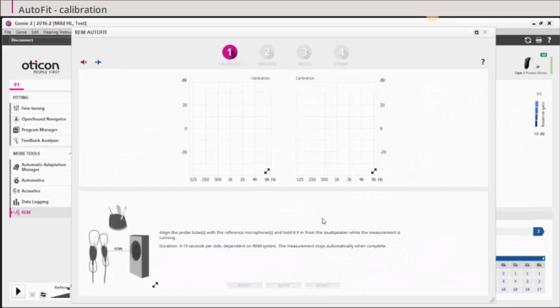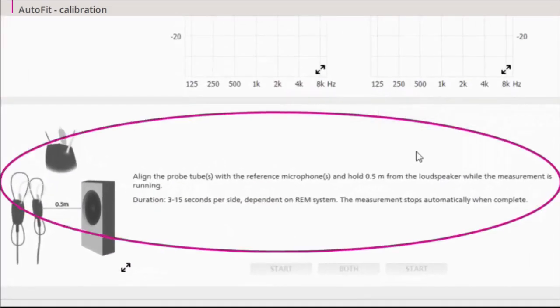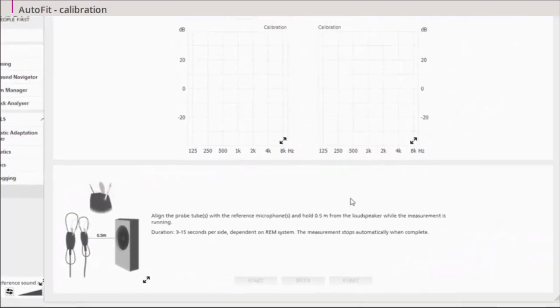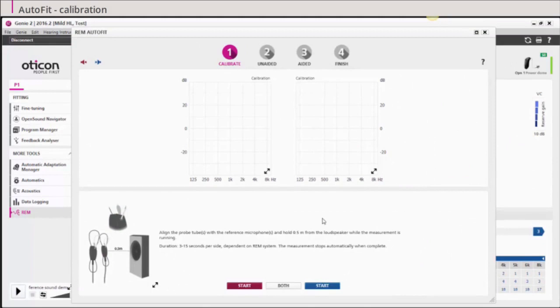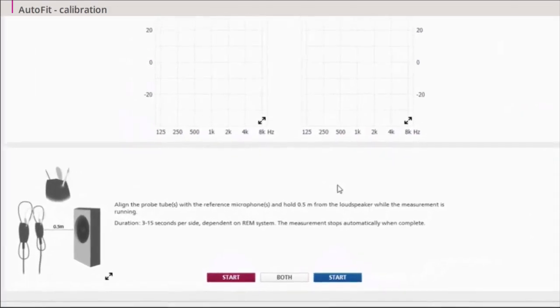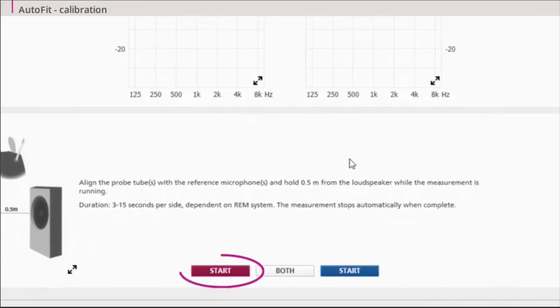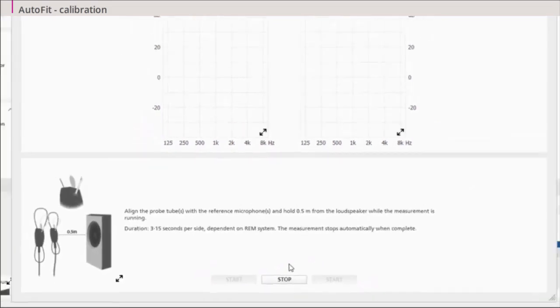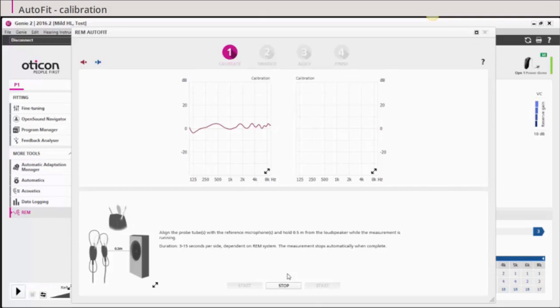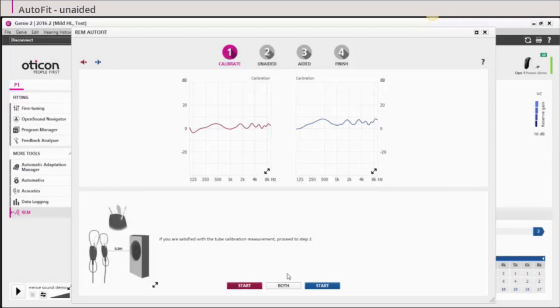To begin the AutoFit procedure, calibrate the probe tubes as shown on the instructions. For further instruction, please refer to the user manual of your specific REM system. The probe tube calibration removes the acoustic effects that the probe tube and microphone may cause during a REM. Press Start to begin the probe tube calibration for the side you wish or both for calibration of both sides. If you click both, the calibration will run simultaneously or sequentially depending on your REM equipment. When the calibration is done, you are ready to do the REM.